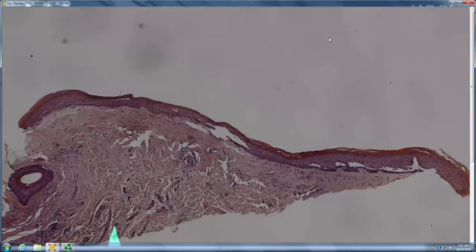How about location? Any clues in the form of all of these little wisps of smooth muscle? General area. It tends to be anogenital skin with all those little wisps of smooth muscle. Very good. And someone who apparently didn't care as much about taking a larger scale sample.